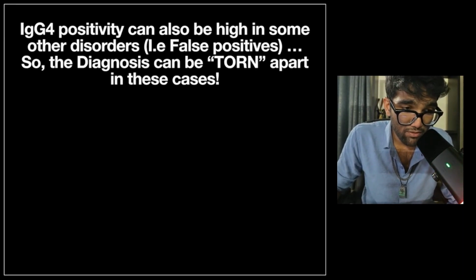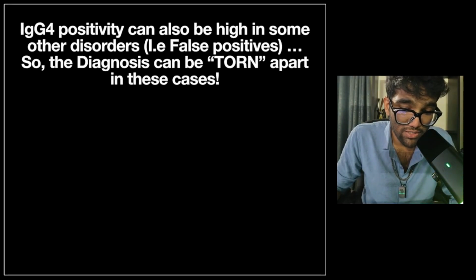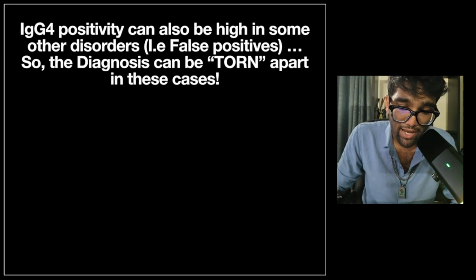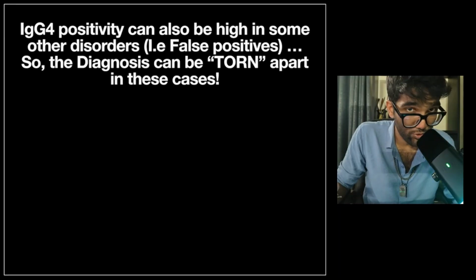My intention here is to appraise you regarding the possible causes of this kind of IgG4 expressing plasma cell infiltration into the lymph node, and to be wary of the fact that IgG4 should not ideally be diagnosed just based on a histopath of the lymph node.